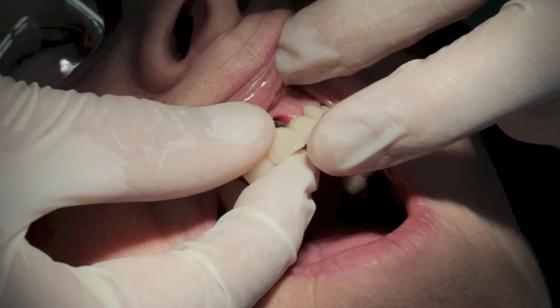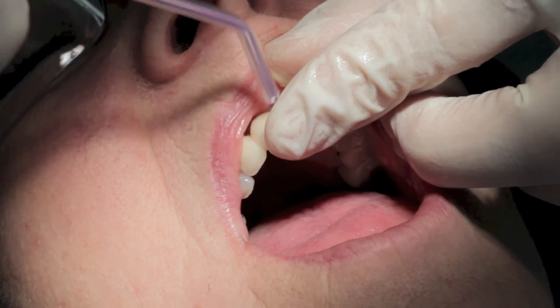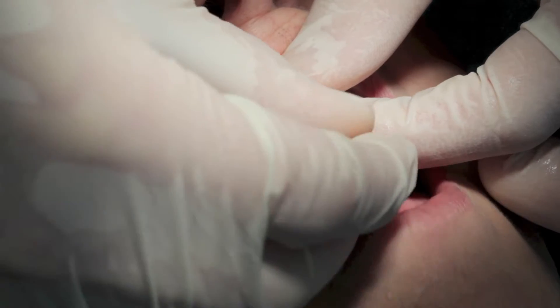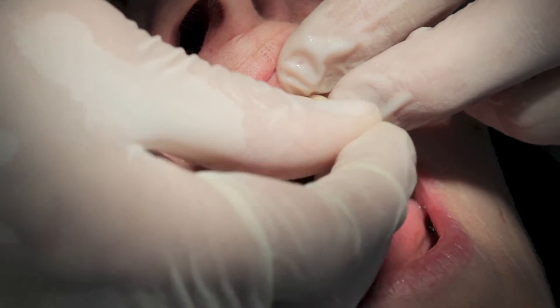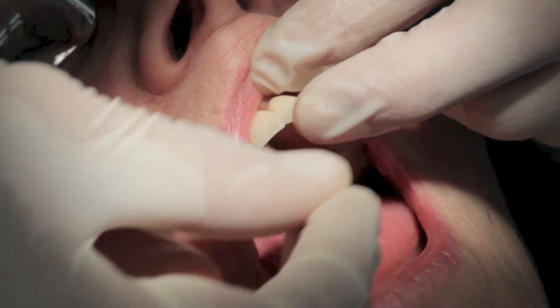So let's try this bridge in once more, again just taking care of the gums which may have collapsed in.